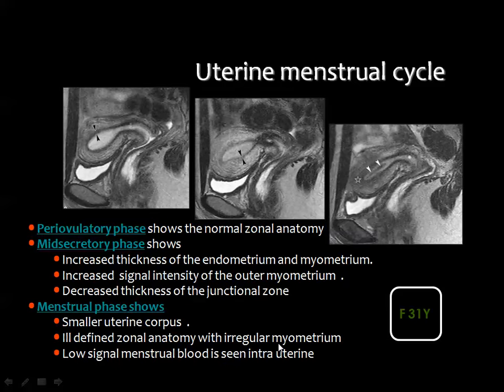There are several changes in the uterus during the menstrual cycle. In the proliferative phase on T2-weighted images, the endometrium is bright, the junctional zone is thin and dark, and the myometrium is gray.